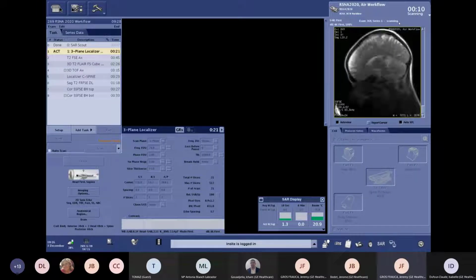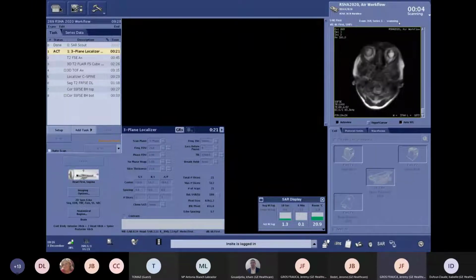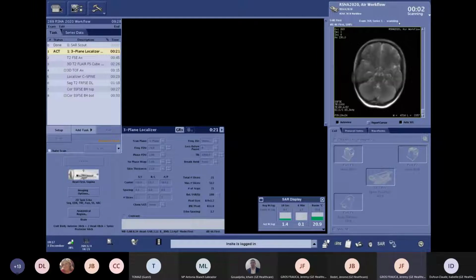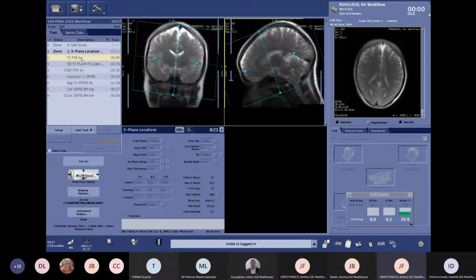And it's smart enough to adapt the coil selection depending on the prescription, I mean, the PSD. For example, if you are accelerating a lot, the system can know that and can select more coil elements because it's needed. Okay, let's run the first sequence. As you saw, we are using the comfort tilt, sorry. And let's open the first sequence.